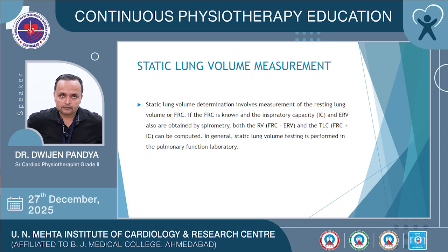If a patient has reduced lung volume, it may indicate the need for static lung volume measurements, because static lung volume measurements can confirm the presence of a restrictive ventilatory defect. Static volume determination involves measurement of resting lung volume or FRC.